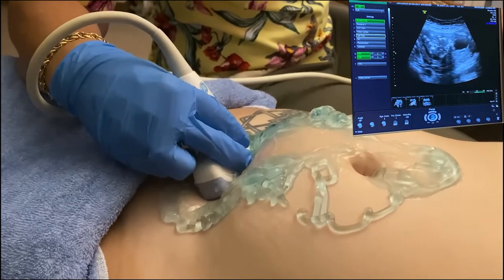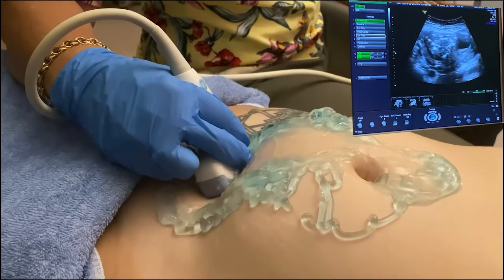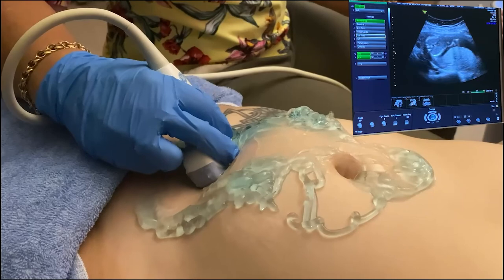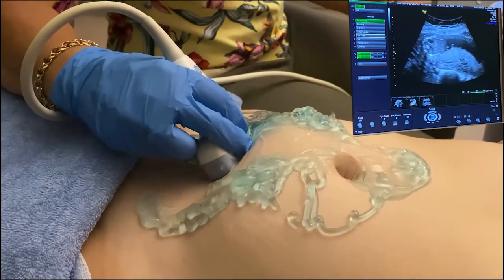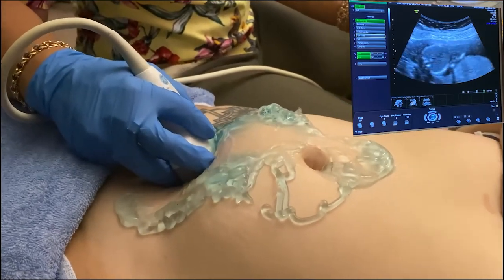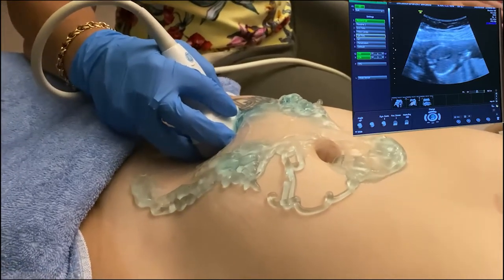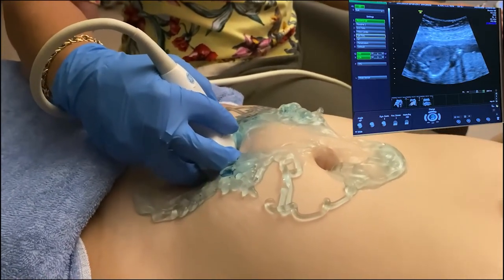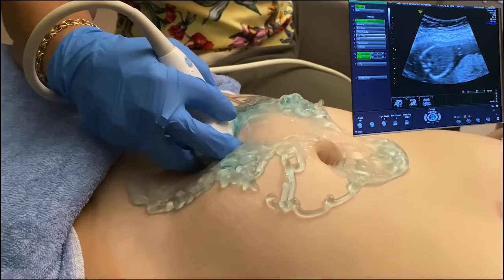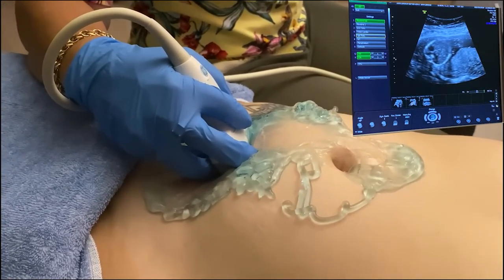And so that means that the spine is at 9 o'clock, the orbits are around 3 o'clock, and so that means that when we go down to the fetal thorax, we should come across the beating heart, okay? And it should be at the top of our screen, and this one is. So this, we say, is situs solitus, meaning it is where it belongs. The situs of the fetus is correct.